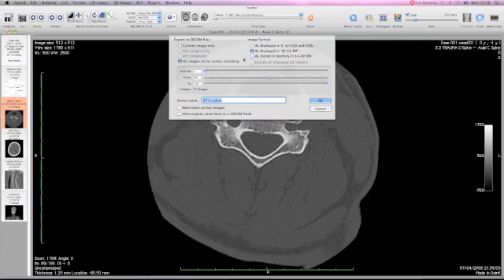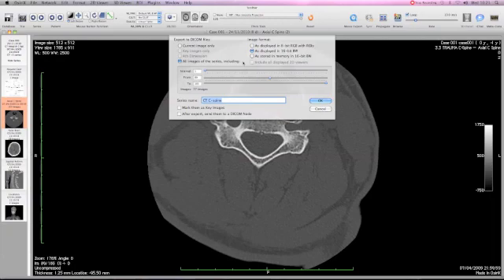The reason we do that is because if we wanted to save them as soft tissue, we could save them as soft tissue. But if we wanted to demonstrate something in a bony window, we windowed this image appropriately and it would save them as bony windows. So we could save a number of different data sets as either soft tissue or bony, and we could save the series name according to the type of data set we've saved.